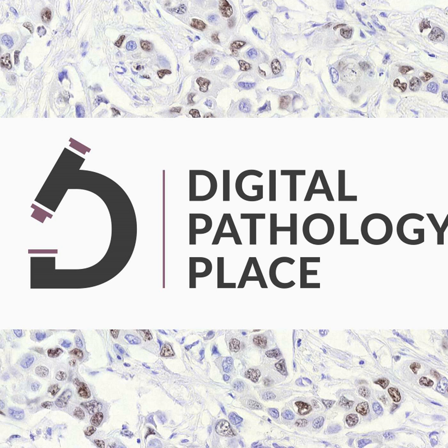They make them with different sizes, obviously sizes that would correspond to biopsies in real life. They varied length from 5 to 30 millimeters with a fixed width of 0.9 millimeters, and also a fixed length of 15 millimeters with varied width. The regions also varied in position within the whole parent section. Then the microscopy was used, and the Q-fibrosis continuous value and stage of the virtual core biopsies were determined.